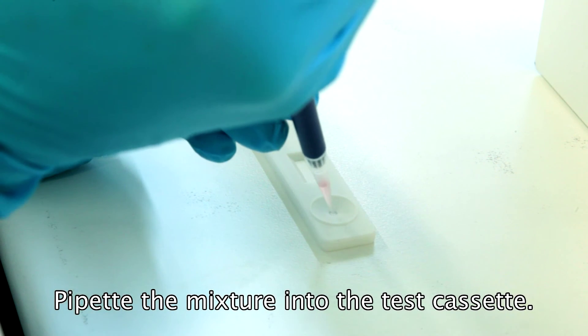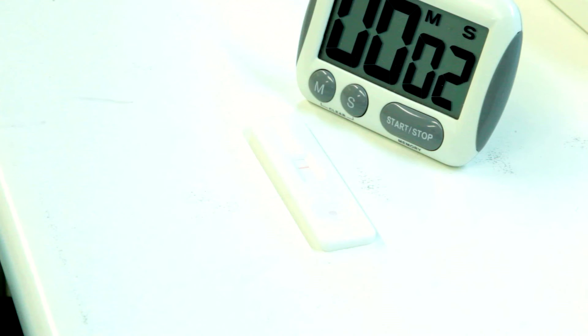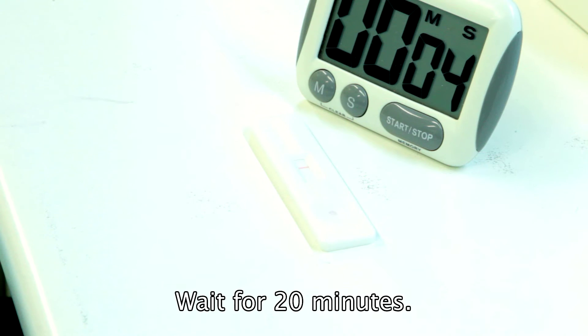Transfer 80 µl of the conjugate sample mixture into the test cassette sample well. Start the timer. Wait for 20 minutes.